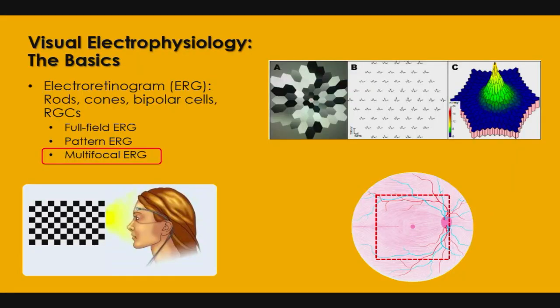The screen, they are not point dots. They are these areas, hexagonal shapes. That's why I brought this. So if you think of this, it's like this, but it doesn't have these square shapes. It rather has these hexagonal shapes. And it will be on a computer screen and it will be flipping, doing something like that. Parts of it will come on, parts of it will go off. And it's quite rapid. I've slowed this one down.